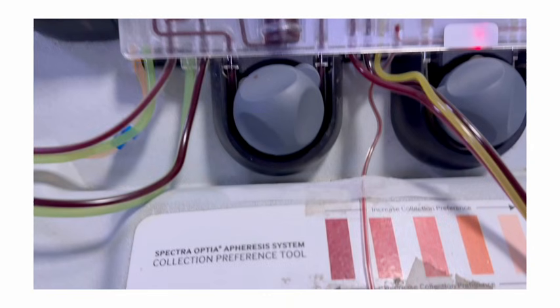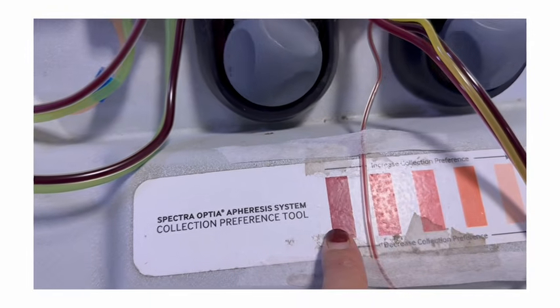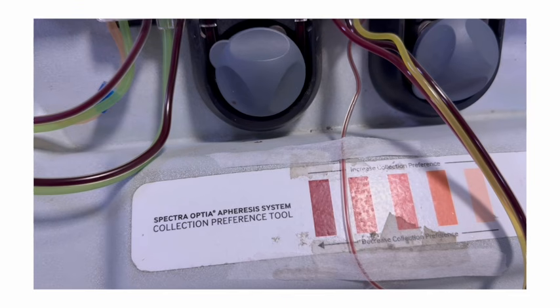Another important step is to match the color of the product with that of the collection preference tool, which is provided with the machine. For granulocyte collection, the collection is always done on the darker side, and the color is matched with the leftmost pattern that is provided in the collection preference tool.